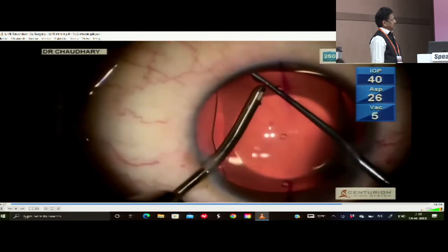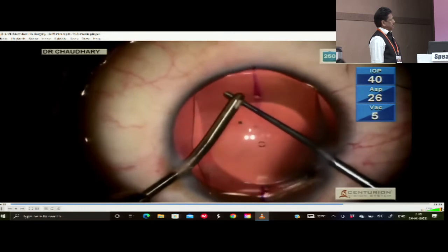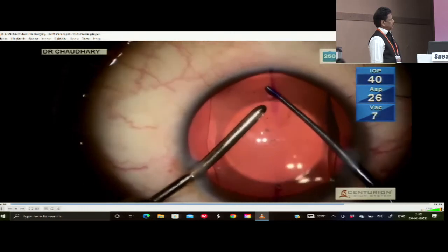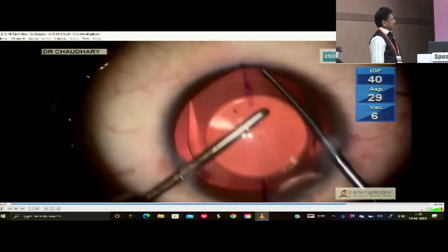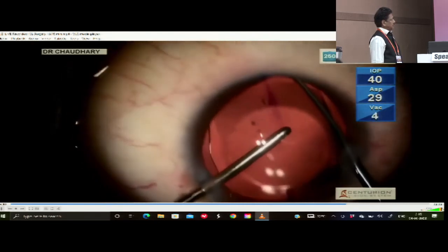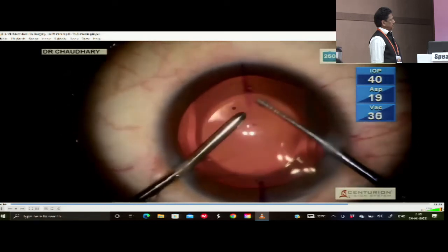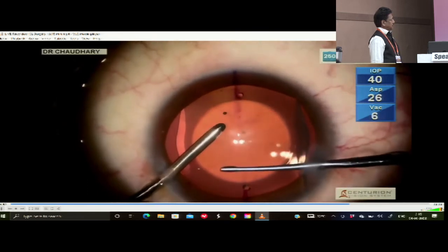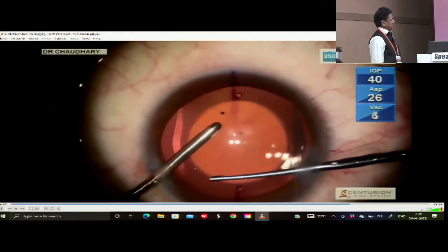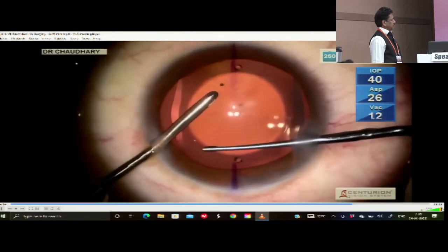So first the distal one and press and tuck. One gone. Simple. The second one, tuck, tuck, tuck and twist, and it goes into the eye. Second gone, and it is on the axis mark which are shown on the cornea. Now you are coming to the third one.